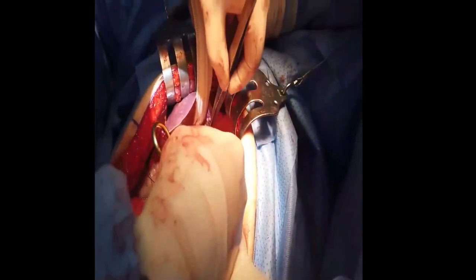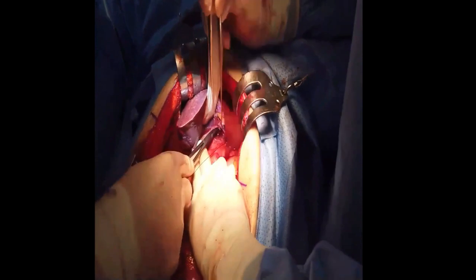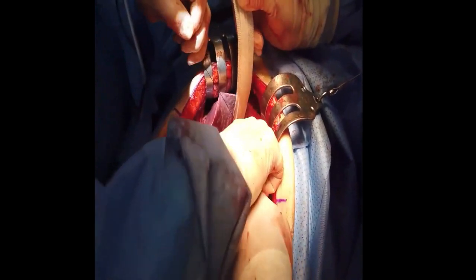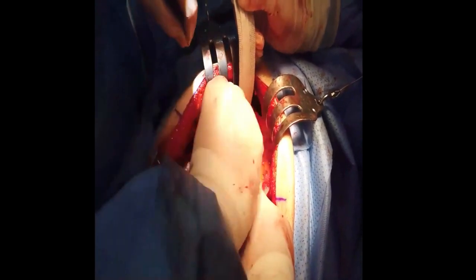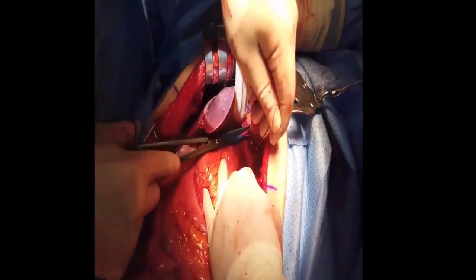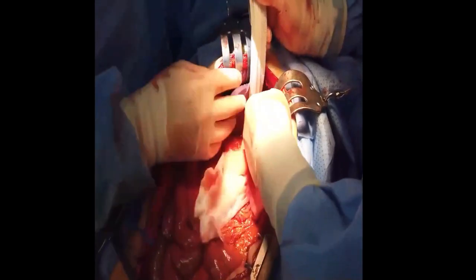Finally, the enlarged esophageal hiatus is closed with 2-0 silk interrupted suture. We used just 1 stitch. We should avoid tightening or narrowing of the esophageal hiatus.